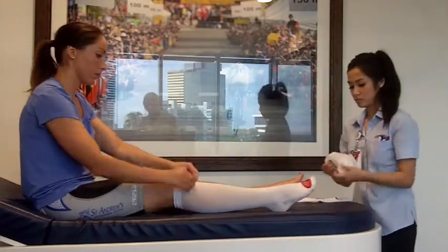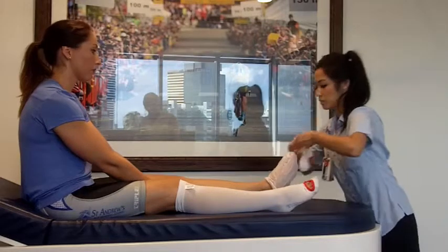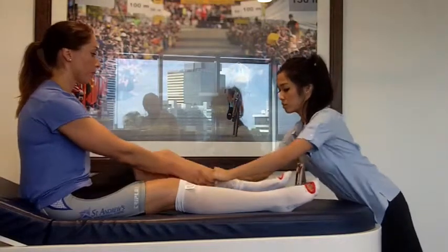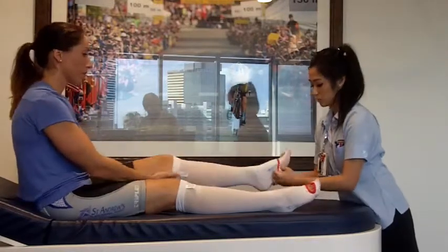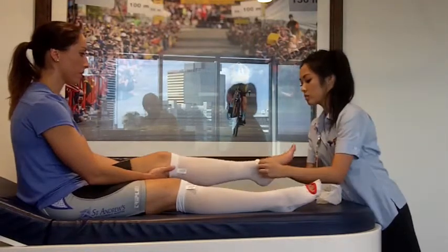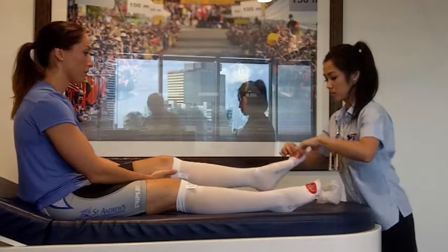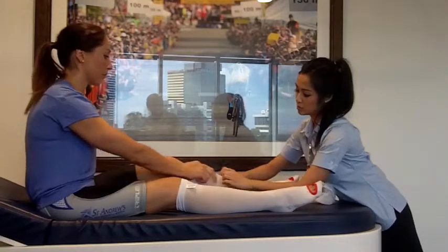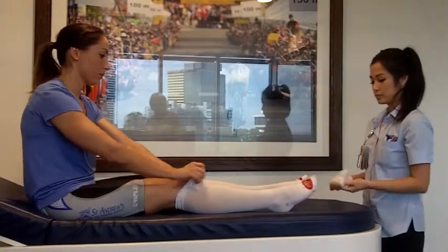You just want them to be nice and firm and feel quite comfortable. If you find that the TEDs are causing you to have red areas around your toes or are causing pressure, it's important that you report it to Dr. Weinerout or to someone, because we don't want you getting any pressure sores on your feet.